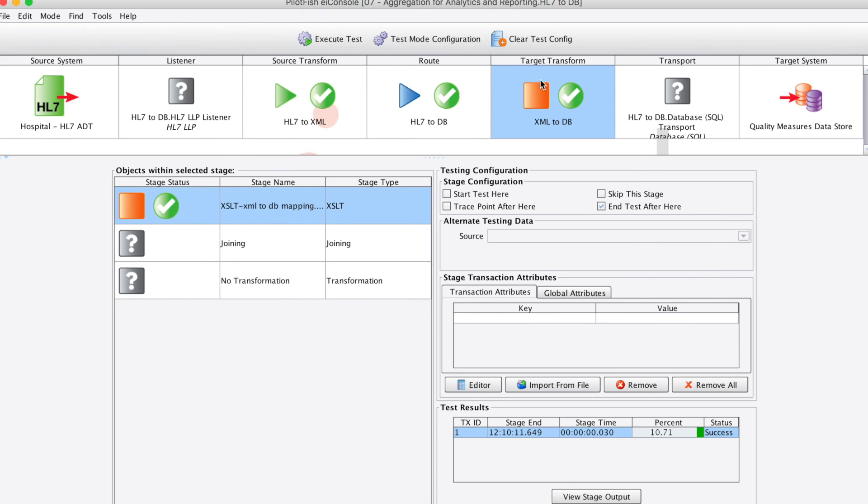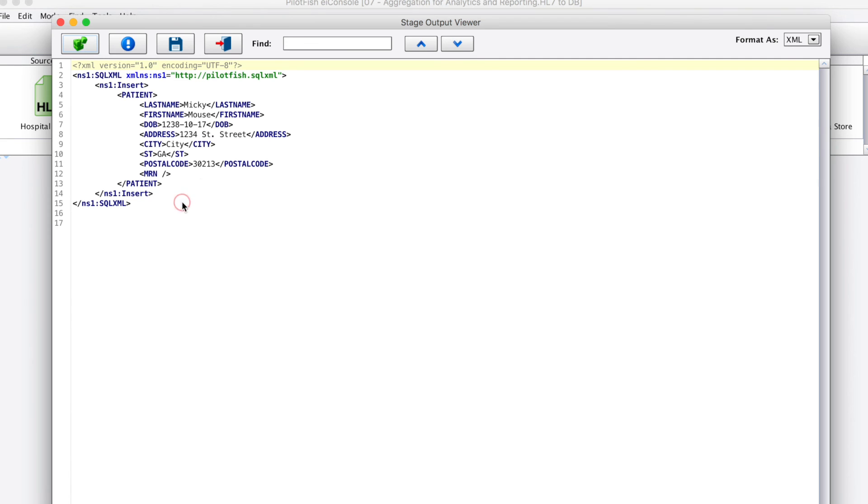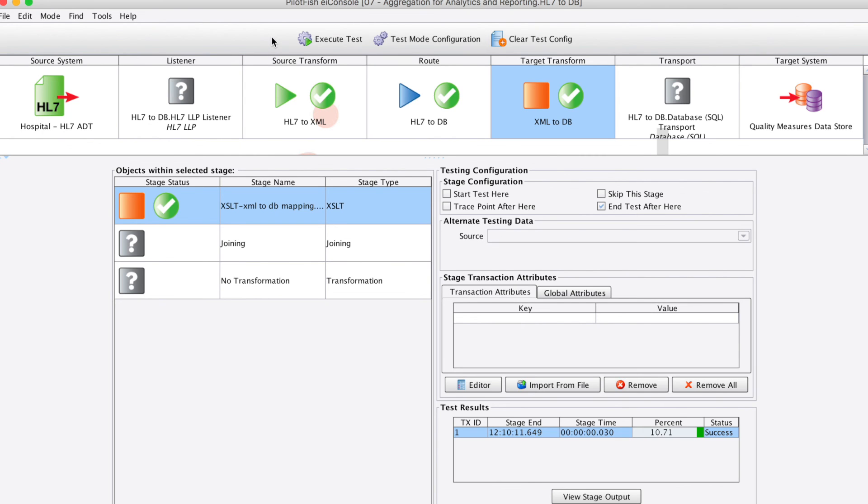To look at our target transform side, here we can see the XML representation of what will happen in our SQL database. That will then be sent on to the live database by entering that connectivity information. And that's all there is to it.